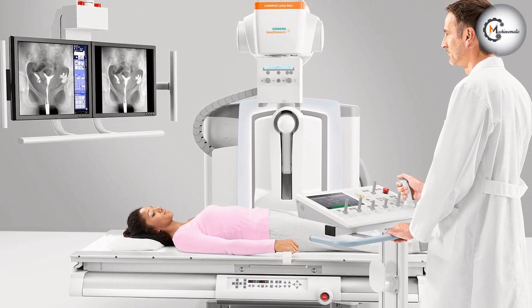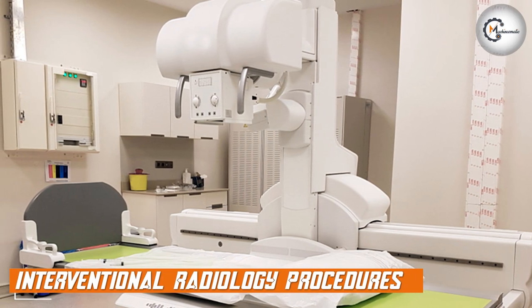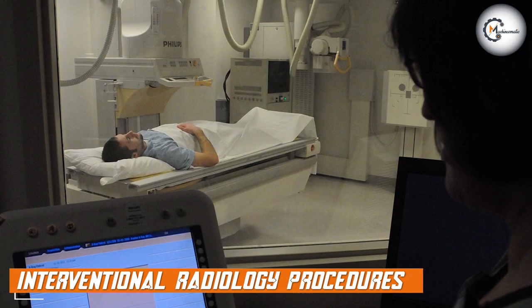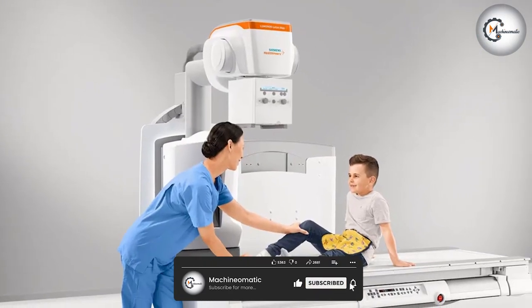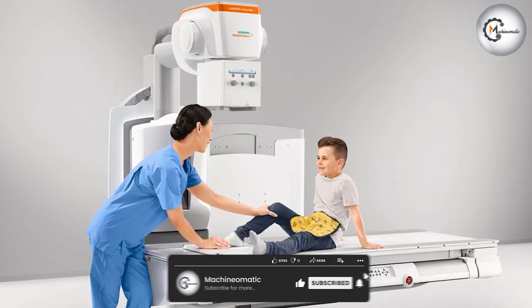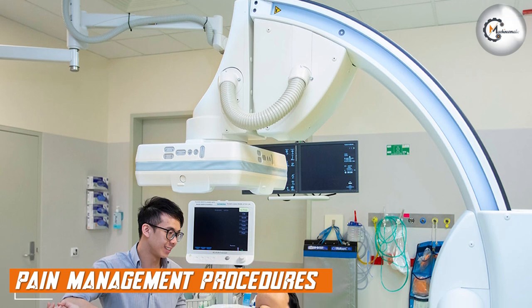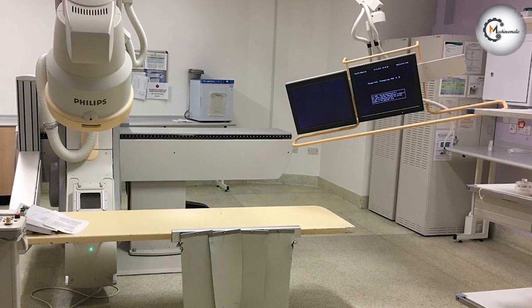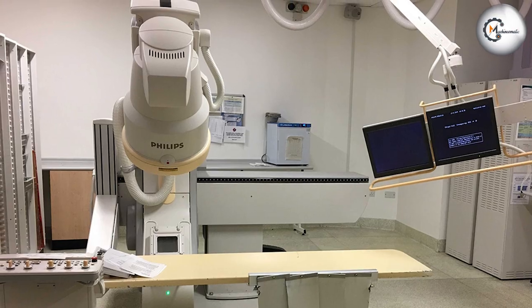Fluoroscopy machines are commonly used for a range of medical procedures, including interventional radiology procedures. Fluoroscopy is often used during minimally invasive procedures like angioplasty, stenting, and embolization. By using a fluoroscope to guide the placement of catheters and other devices, doctors can perform these procedures with greater precision and accuracy. Fluoroscopy can also be used to guide the placement of needles during spinal injections and other pain management procedures, helping ensure that medication is delivered to the correct location and reducing the risk of complications.